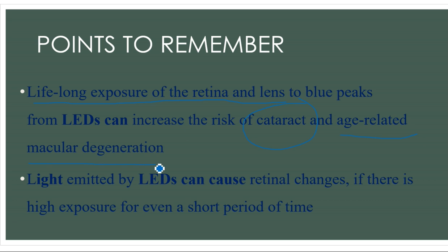So it is not advisable to look directly through the light cable or through the tip of the laparoscope. Why? Somebody might look at the tip of the laparoscope just for fun. So don't look directly at the tip of the laparoscope or at the distal end of any light cable if it is functional at that time, if the light source is on. Light emitted by LEDs can cause retinal changes also.